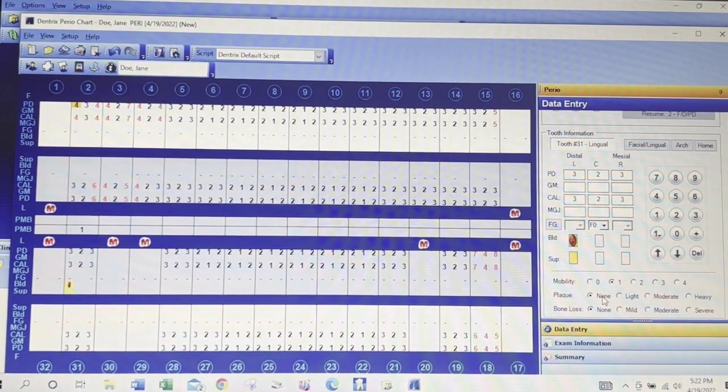Again, the doctor or the hygienist is the only one that does that, but they will call you in to write down these periodontal numbers for them, because you can see that it would be very hard for them to be probing 6 numbers per tooth and stopping to enter this in the computer. So the assistants a lot of times will be doing the periodontal charting. So you literally just follow the numbers.